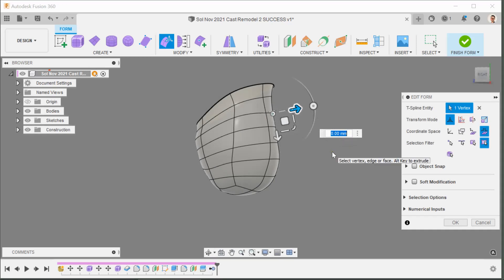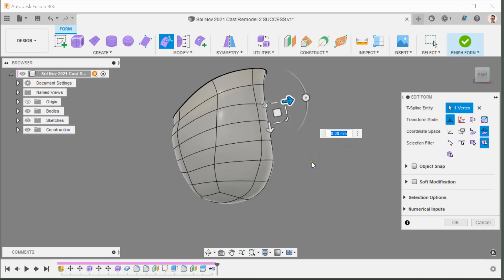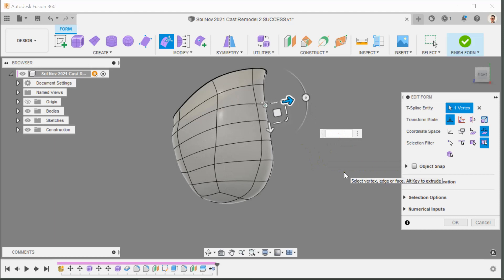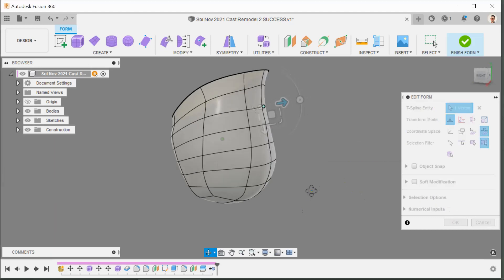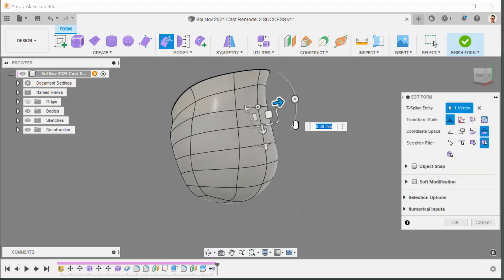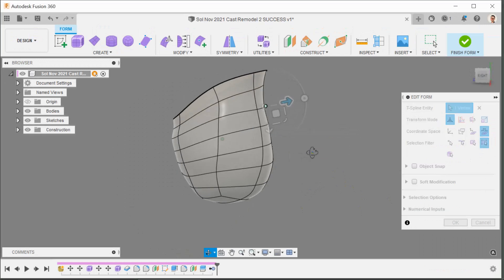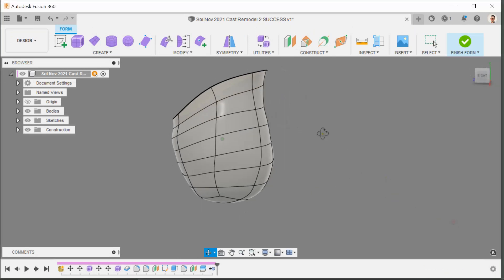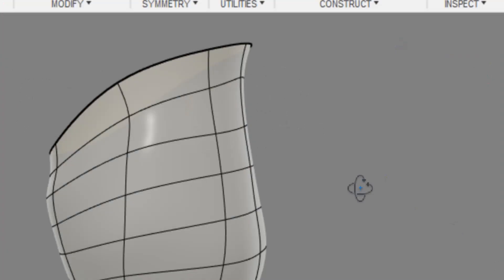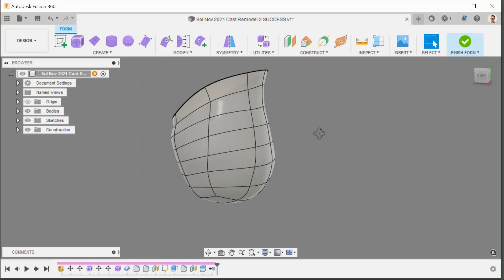I want to pull this point inwards. The arrow is pointing to the right, so I need a minus number — I'm going to do minus 2 millimeters. Working within only these four squares, I've only made a change that affects those four faces. Here's the before and after.